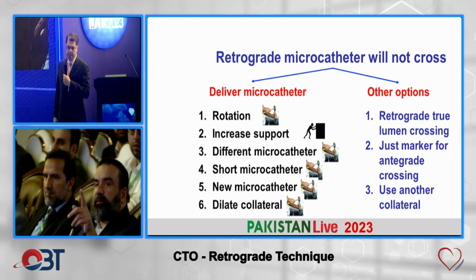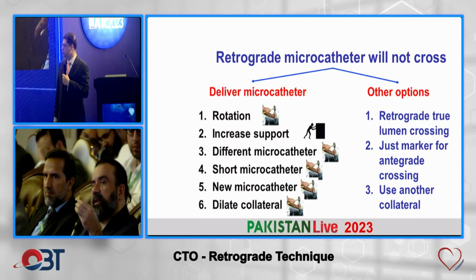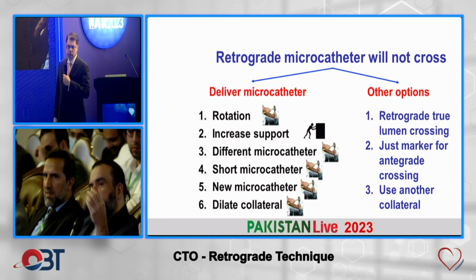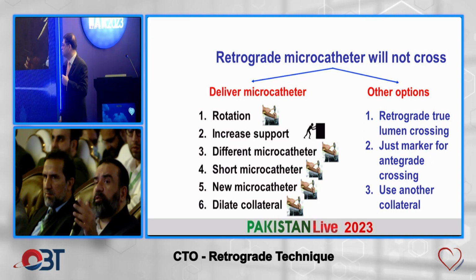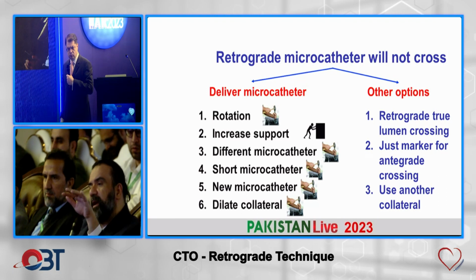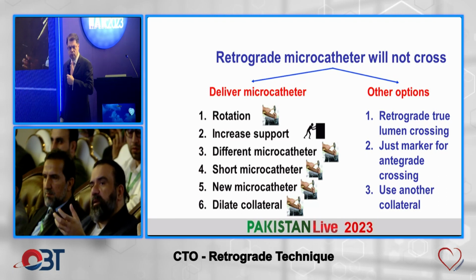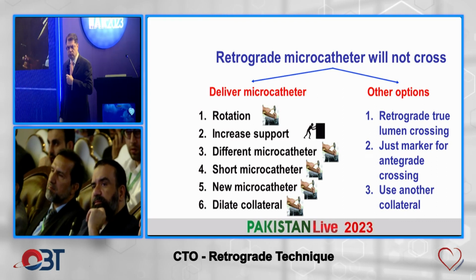And for epicardial, for the same reason, because epicardials are very easy to avulse and cause trauma, anything bigger than the Turnpike LP or Caravel will be too traumatic. Now Gold you can use if you've crossed a microchannel but you need some grip on it. But in my experience, if you have enough support, a Turnpike LP will do the trick. You don't need a Gold.